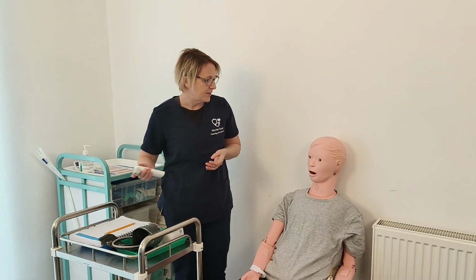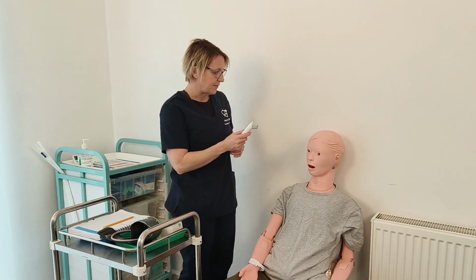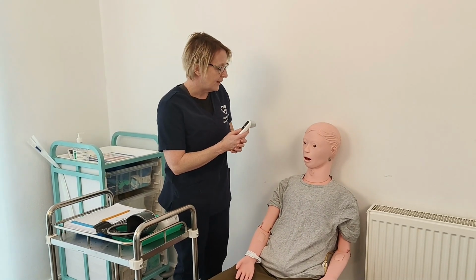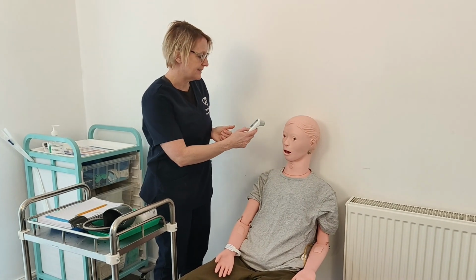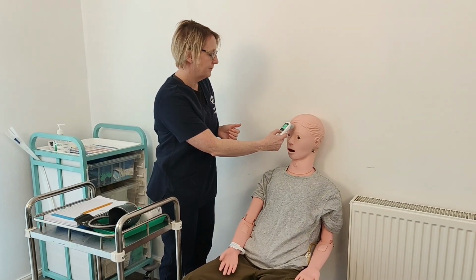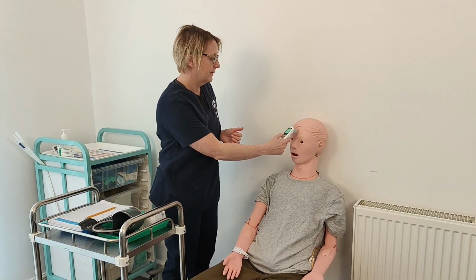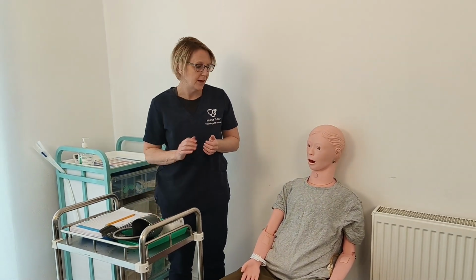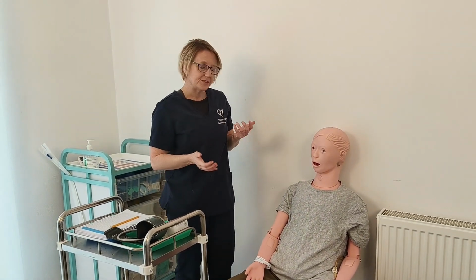So first off, I'm going to take Rose's temperature. So Rose, I'd just like to take your temperature with the infrared thermometer. I'm just going to place it just away from your forehead. I can see there's no hair and the skin is clean. Okay, so that is 36.8, which is normal. And Rose, on your body from head to toe, have you got any bruises, rashes, bleeding or any injuries at all?